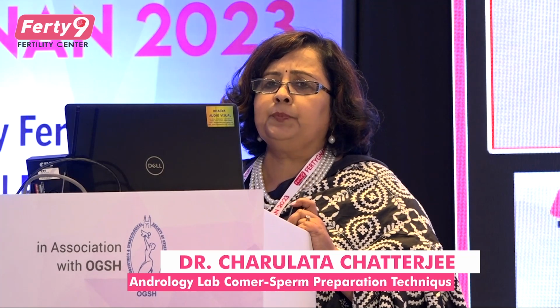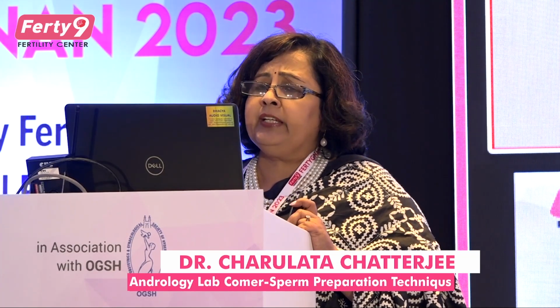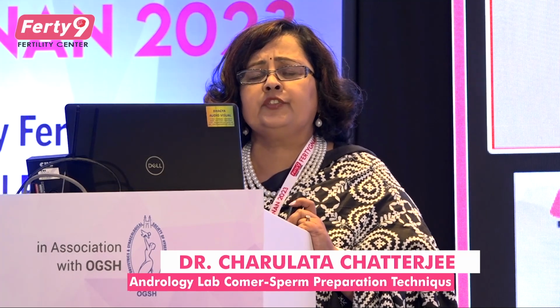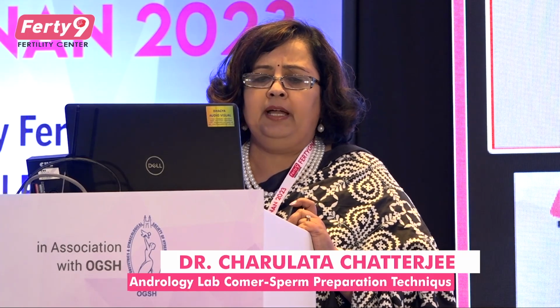In that case, the final sperm volume is more than 0.5 ml. We can use this for IUI, conventional IVF, and for ICSI also. There is literature which gives the evidence base that microfluidics reduces DNA fragmentation and can be used as an advanced sperm preparation method in the ART laboratory.